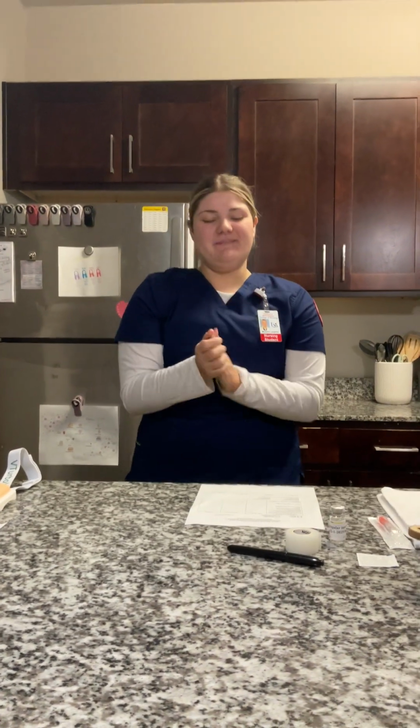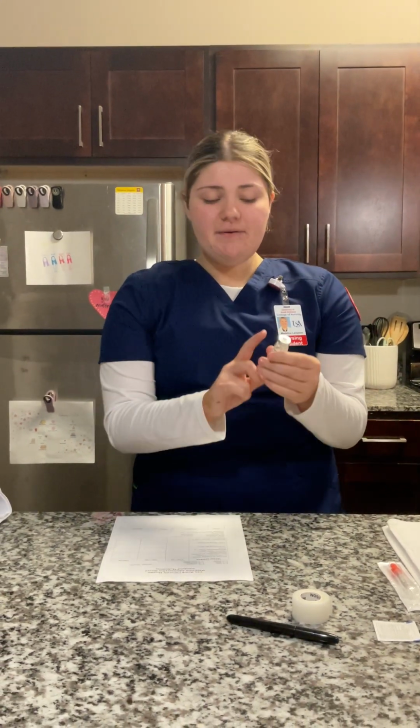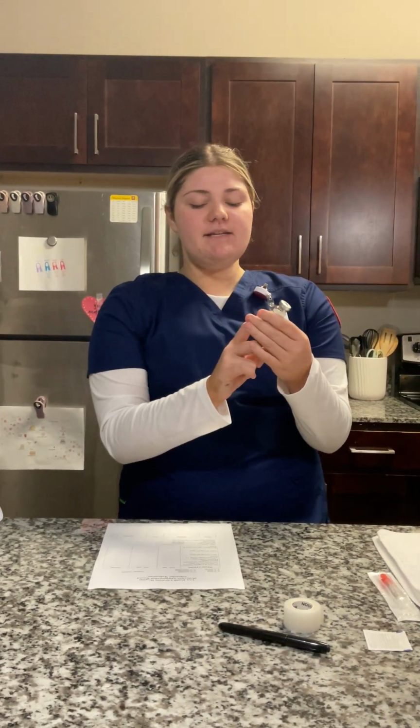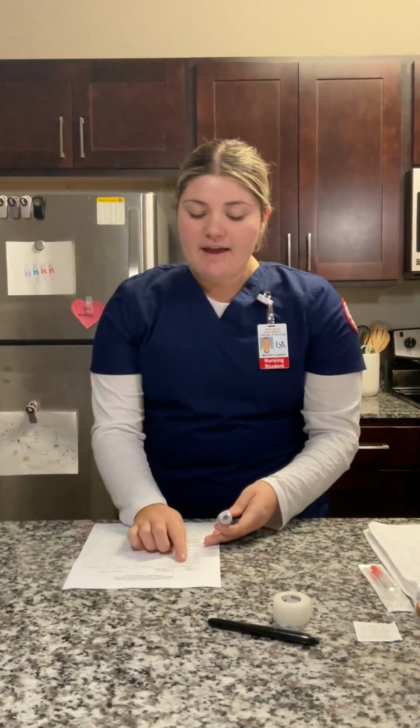So now I'm able to get rid of my patient care order form, and I will perform hand hygiene. So now I'm going to take a look at my vial, and the first thing I'm going to do is make sure it is still for Jaguar J. Jones, and so it is Novolin R regular insulin, and I'm also going to note the expiration date, which is 12/1/2025, which is still good to use.